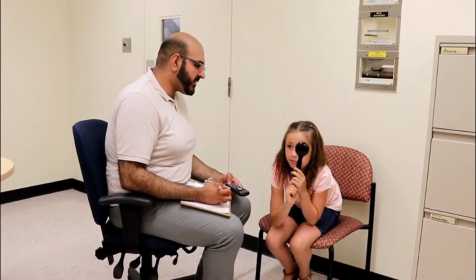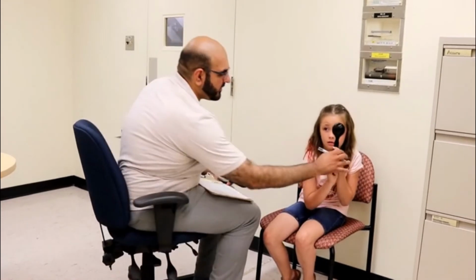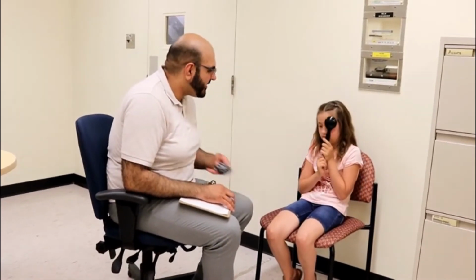A R K S O U D H Z K S N. Lean back, it's okay. B A G C R D K. No thinking. I want to make sure you're just using that. Good job. Okay, keep it covered. And we're going to make them a little bit smaller.